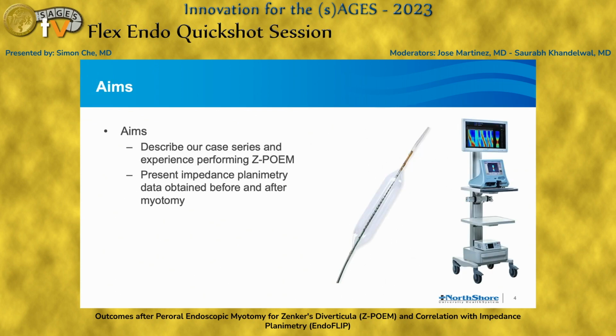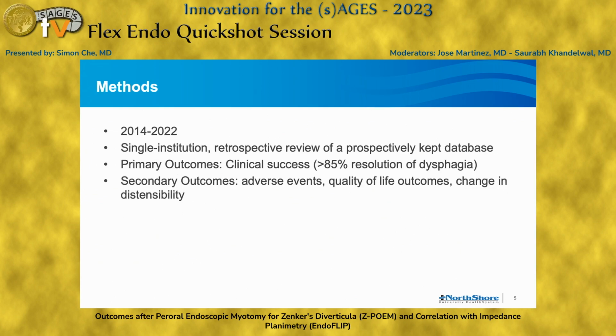The aims of our study are to describe our experience in performing the Z-POEM procedure, as well as to report our impedance planimetry results before and after myotomy. This is a single institution retrospective review of a prospectively kept database. All patients from 2014 to 2022 who underwent Z-POEM were included.